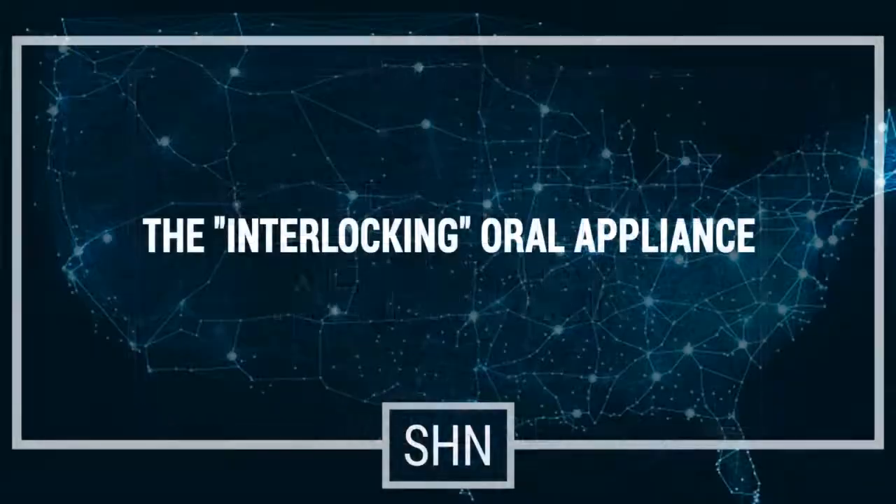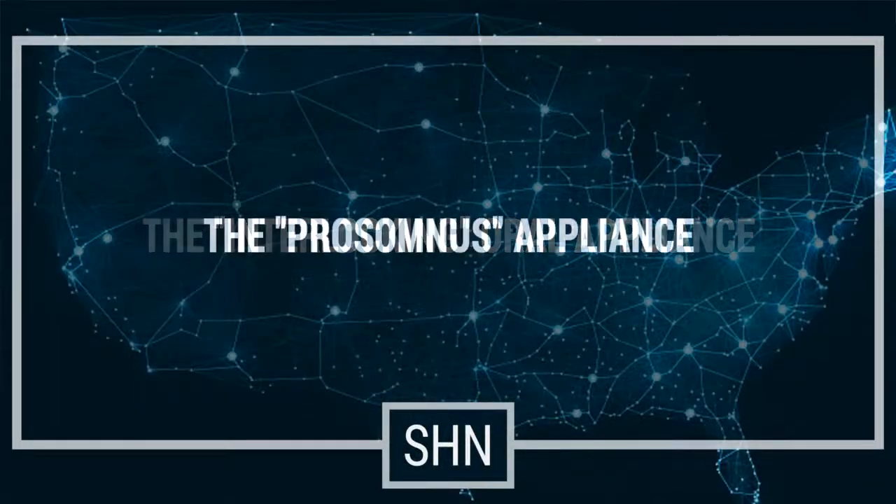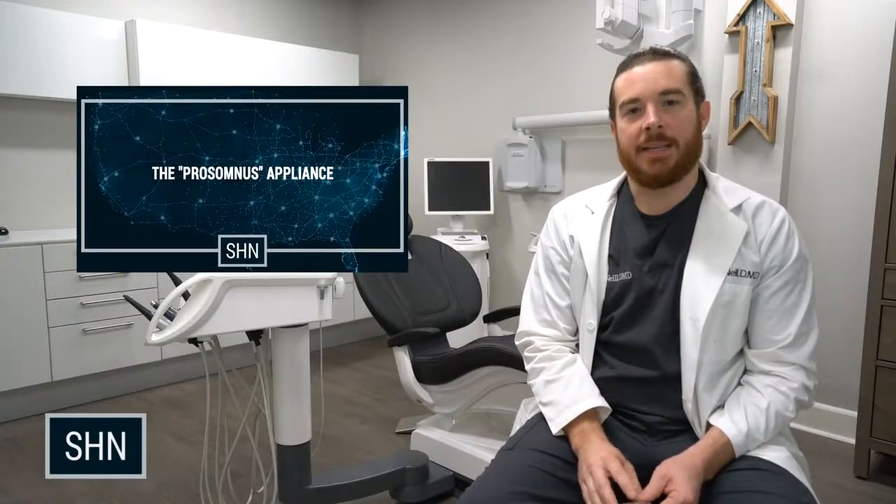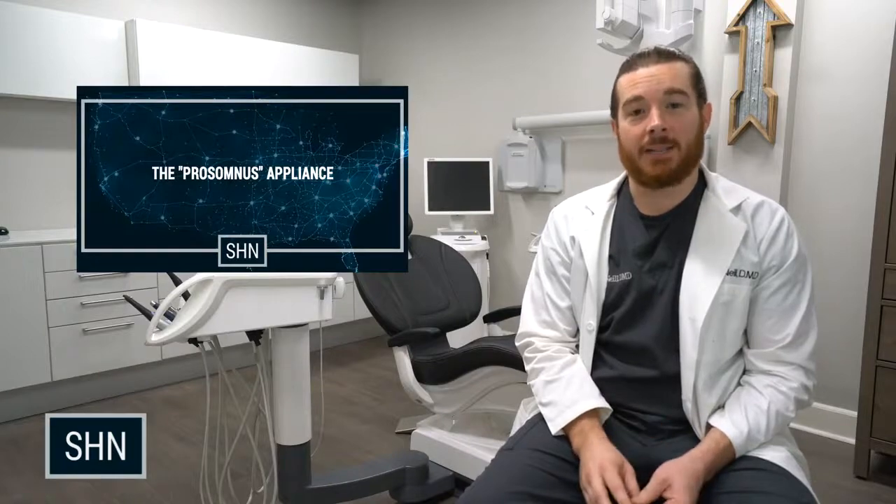In this video, we're going to look at the interlocking oral appliance. We'll be looking at the ProSomnus Micro 2 appliance. There are a couple of features that I really like about this appliance, and each of these features can be customized on your prescription form.